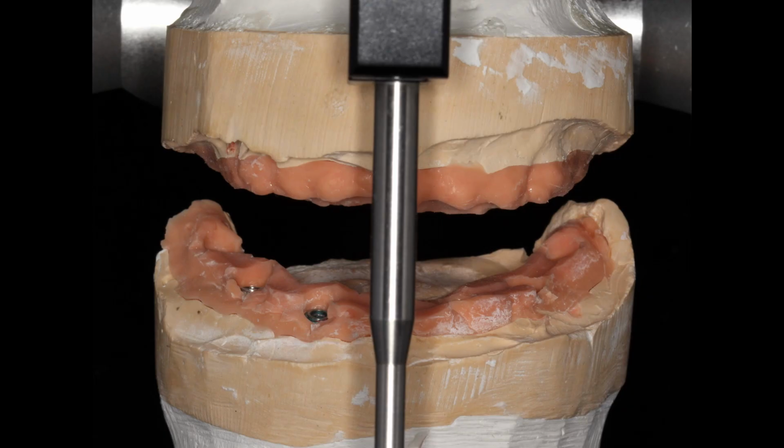Once we have both upper and lower master casts, we then put them on an articulator. This is a device that simulates the patient's jaws so that we're working as close to what the patient has as possible.